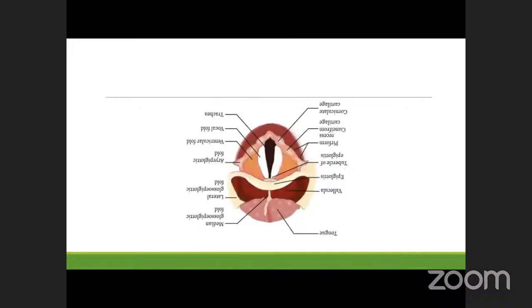For those who have intubated before, this should be a picture you're more familiar with. This is the way you would see it at the head of the bed. But why does this picture matter if we're talking about LMAs? Does the anatomy matter if we're talking about LMAs? It matters, but you will not see this when inserting an LMA.